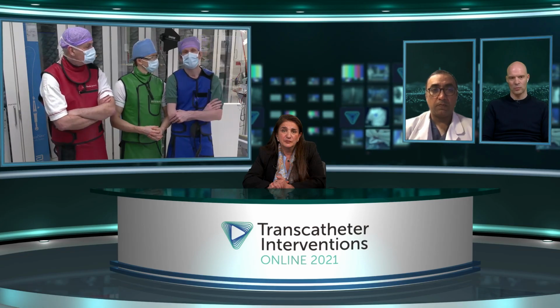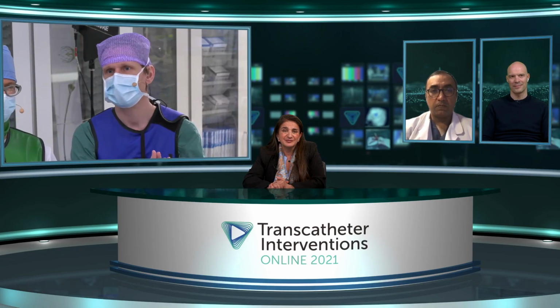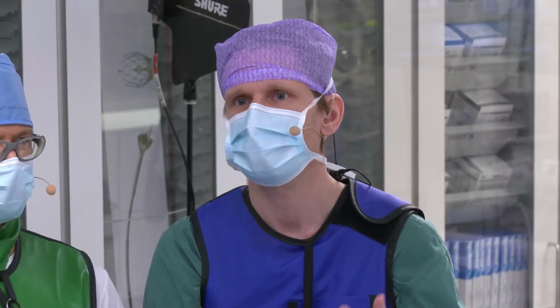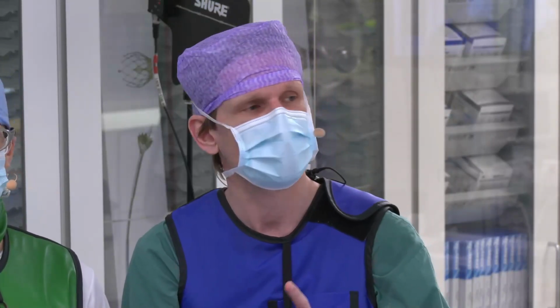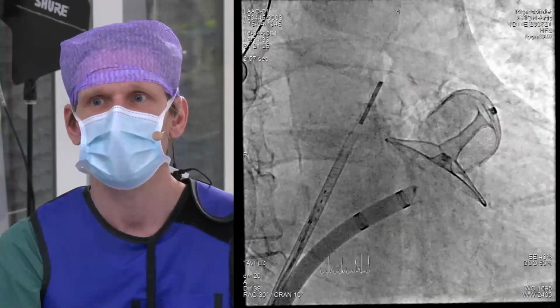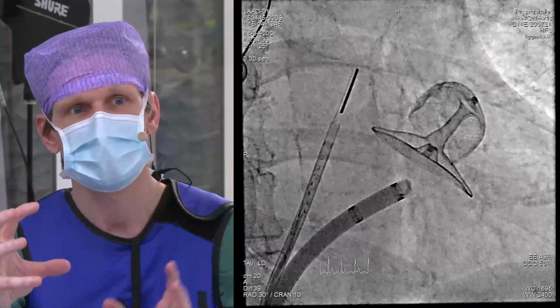Ole, why specifically this device? Well, I think if you look at the anatomy, this device is really excellent in a chicken wing anatomy. Maybe if we can have the fluoro on the screen again for just a second, then you can actually appreciate how flexible the cup and the disc are.